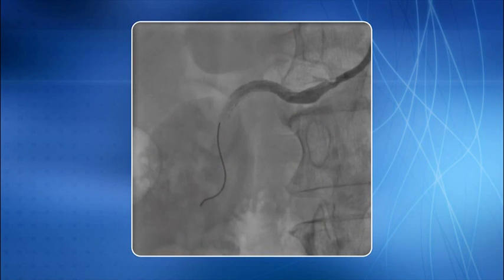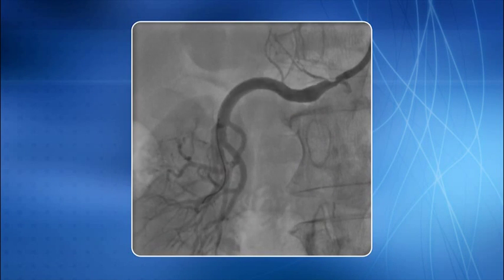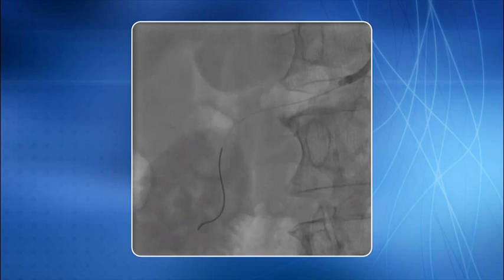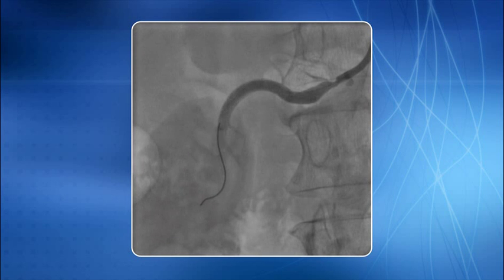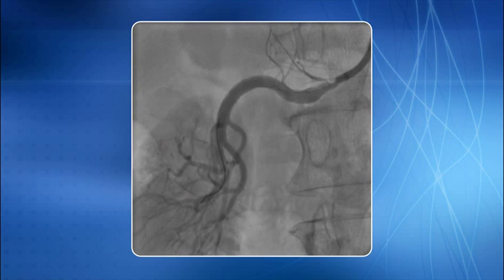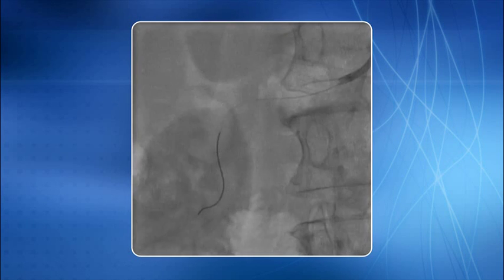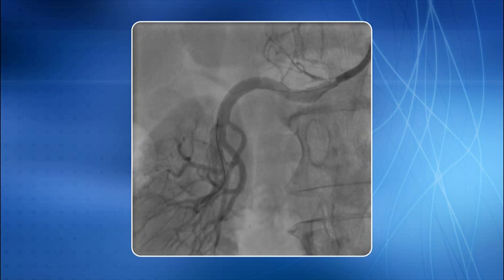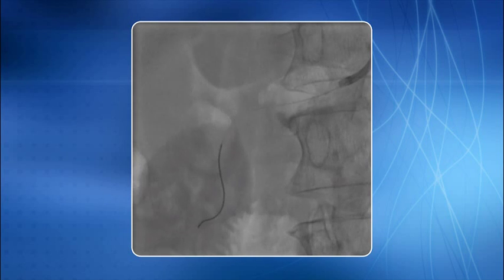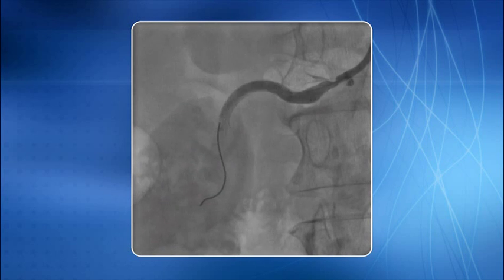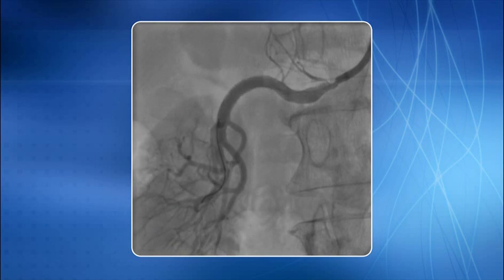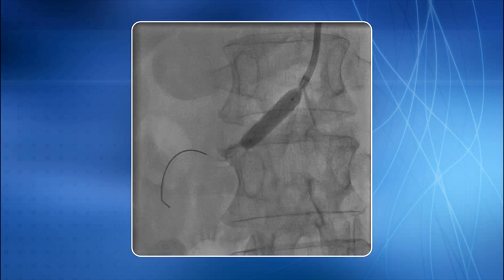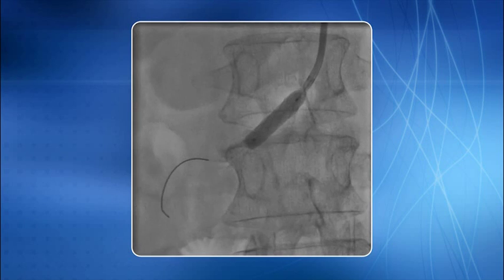This is a case of right renal artery ostial stenting using a left transradial approach. The renal artery ostium was cannulated using a 6F JR4 guide catheter and the lesion was profiled. The lesion was then stented in the usual fashion.